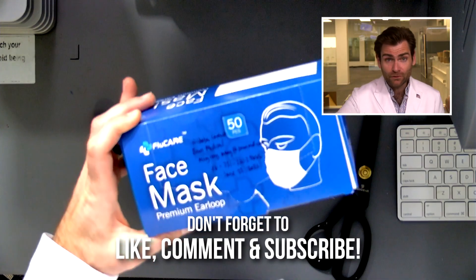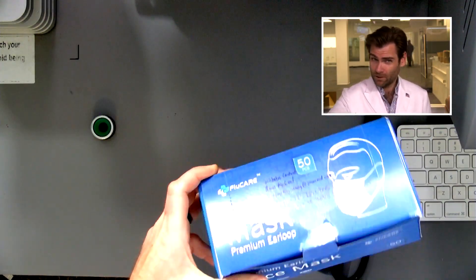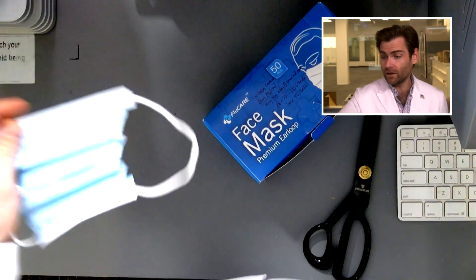Hey everyone, welcome back to the place where we're testing every single mask in the world. Today we're looking at FDA-cleared masks that we could not find on Amazon, so we had to reach out to the manufacturers themselves. This is the Flu Care mask. Let's put it in the clamper and see how it tests.